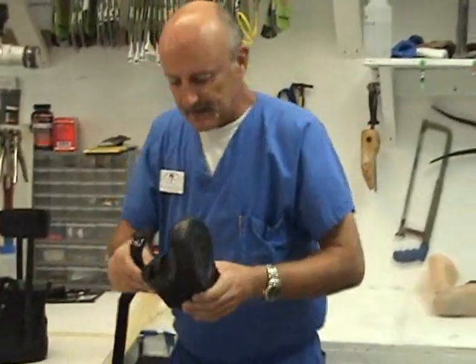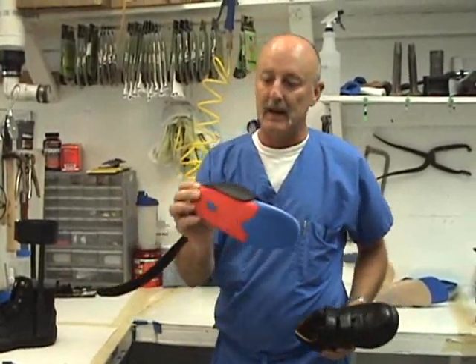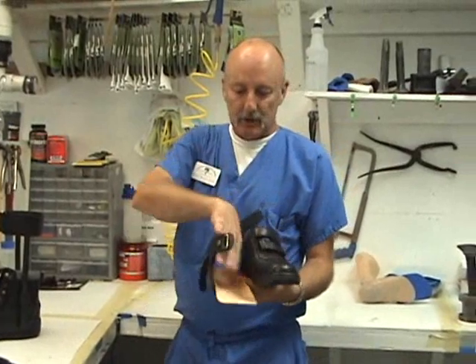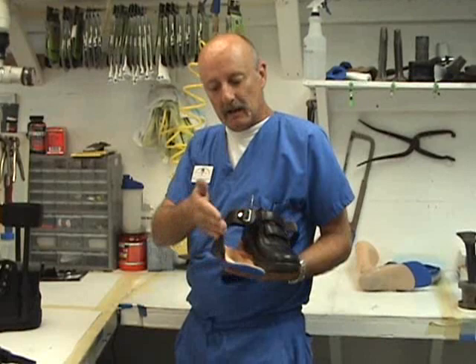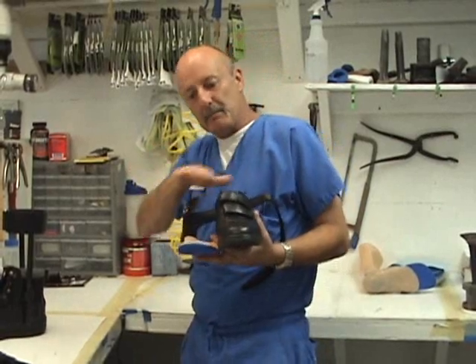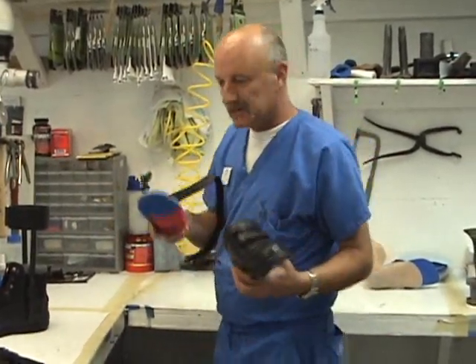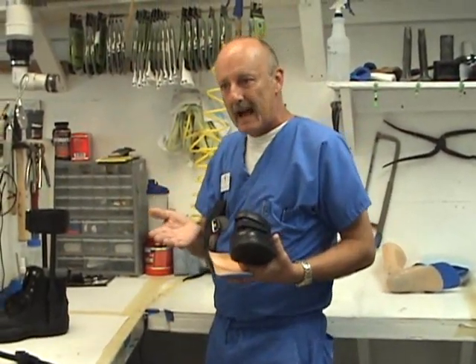Also, as an aside, this one has a T-strap. I like to attach the T-strap to a custom foot orthotic so you get good arch support, and then the T-strap works to pull the medial arch up, getting a more effective pull for someone who has a mid-arch collapse. This design would be for someone with posterior tibial tendon dysfunction that has progressed to basically collapse.